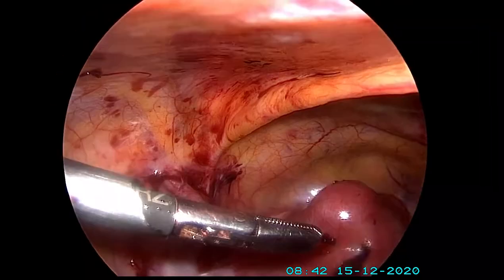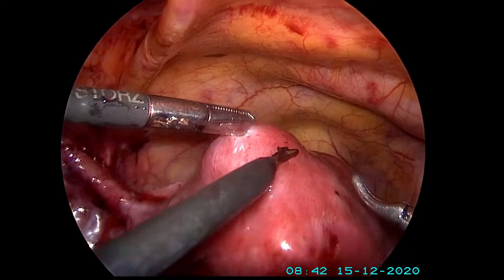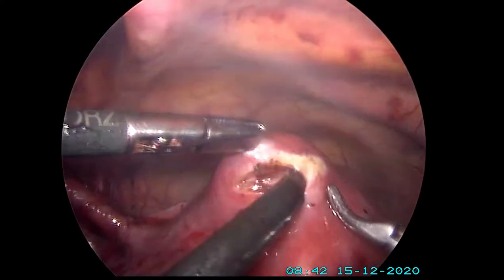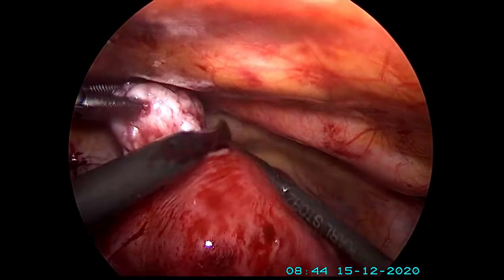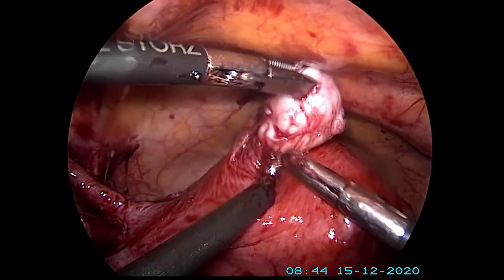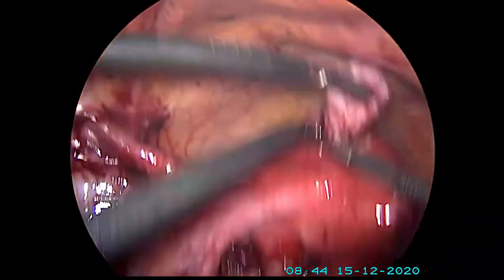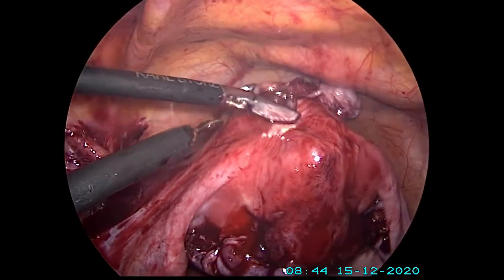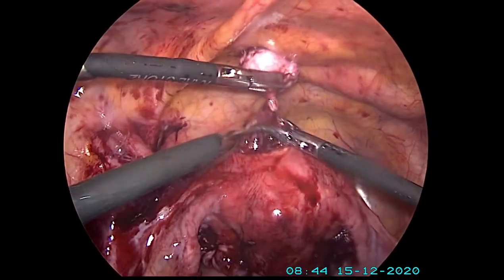The inside is being cleaned, and we have yet one more fibroid — in front of, rather on top of, the uterus. Since we are removing the fibroids, we may as well remove this one as well, although it is very small, just about 2 to 3 centimeters. The same technique is employed: the outer capsule is cut, and the fibroid is pulled and peeled away from the capsule.